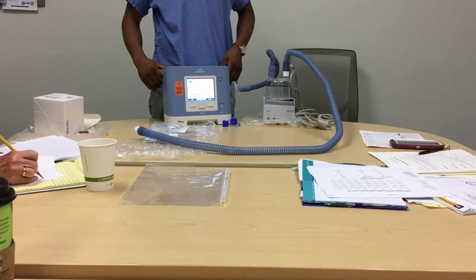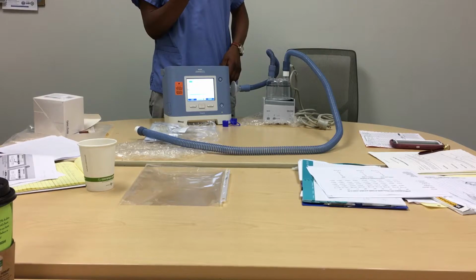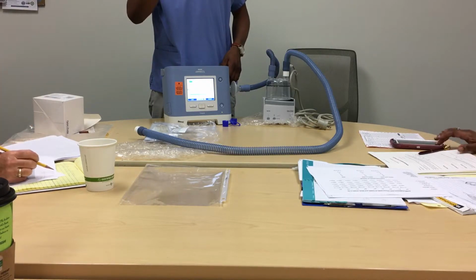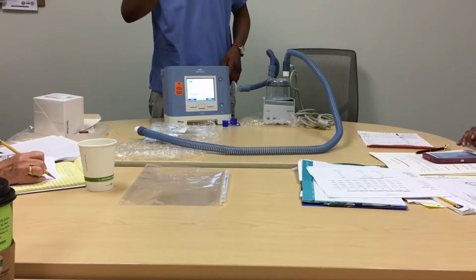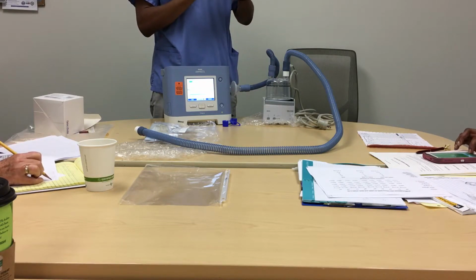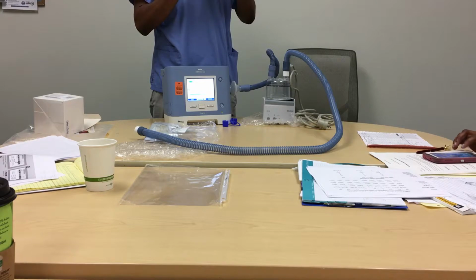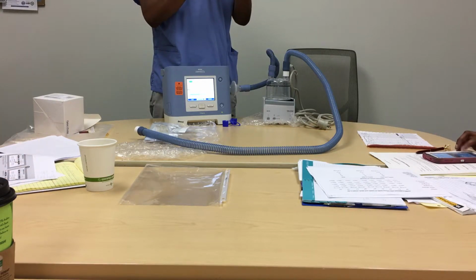I'll take a case in point. There is this guy I was taking care of. He was on the ASV, but he couldn't pull sufficient volumes. Even with the sensitivity and pressure changes, he was still not getting what he was supposed to get. So in order to assure those volumes, we had to switch him to the AVAPS.